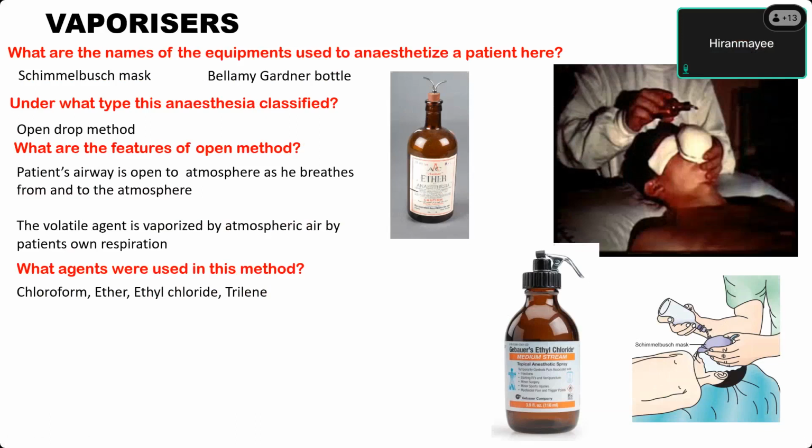So once you release the lever, how will it come out? At very high pressure, high concentrations. Very good. How much high pressure? 15 degrees is the boiling point, and room temperature is almost 28 to 30 degrees in Chennai, so it is twice. How much pressure will it develop inside? At 15 degrees, it should equal 1 atmospheric pressure. At 30 degrees, 2 atmospheres.